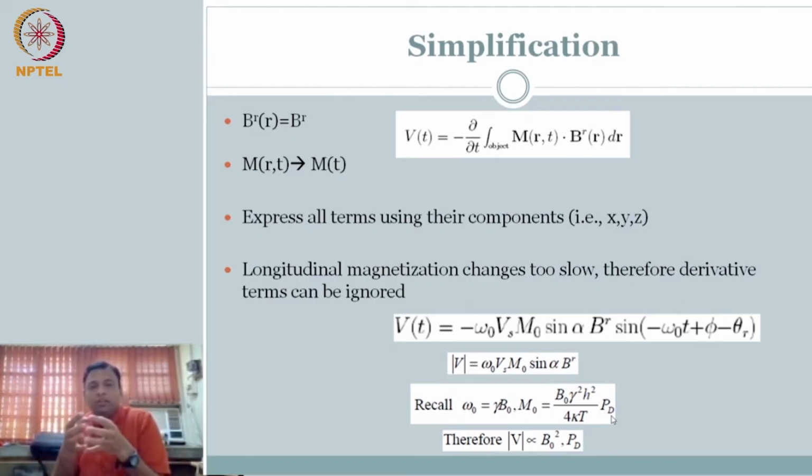If I increase the volume, yes, I can increase my signal, but then what is happening? The resolution is going to go down, right? I can say I get this net signal from the head, which is fantastic. I'll have a lot more signal. But then I'm interested in seeing the changes within the brain. So I need some smaller volume so that I can localize better. So this is the inherent trade-off that we'll have, right?